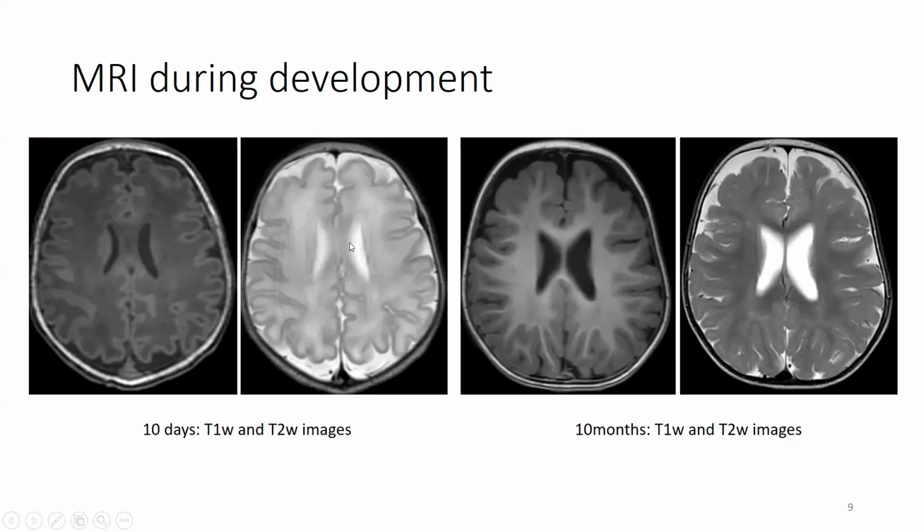And again, you recognize it by the CSF signal. And this is the T1 weighted image. But you see that the contrast here in this very young child is different: the white matter is gray, and the gray matter is even brighter. And also here, the contrast is almost completely reversed to that of a T2 weighted image. What is the main thing during development in the first couple of months? What changes in the brain? I'm looking for one phrase, one substance. Any one of you know?